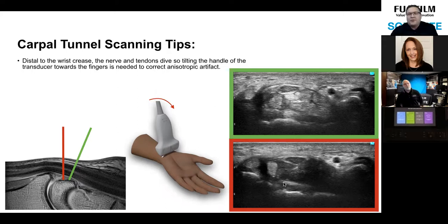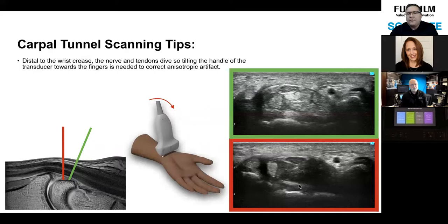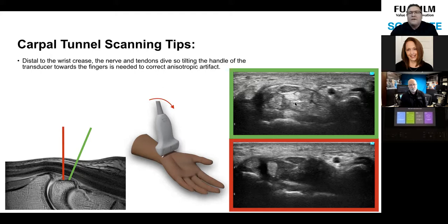Against the carpal floor are ligaments — there are lots of ligaments that hug the carpal tunnel floor. They are anisotropic, so don't call this a fluid collection. You can see the FPL and FCR, and how the carpal tunnel flexor retinaculum dives vertically — it's perfectly anisotropic, not fluid. See the difference in these two images — how you might call something a fluid collection versus having the probe 90 degrees to the actual target of interest.